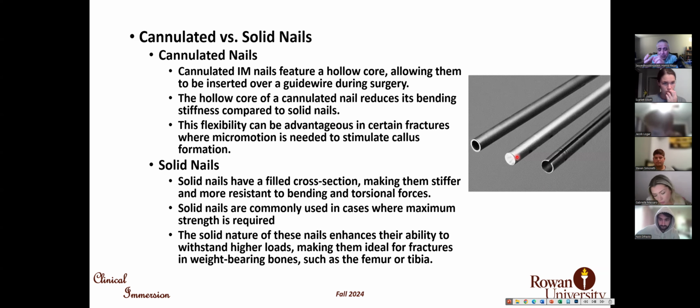If we use a cannulated nail, you will see first we have to put a guide wire, and then perform reaming, and then change the guide wire, insert another one, and then insert the nail. And it takes about 1 hour. But if we use the solid nail, we open the medullary canal and insert the nail, and it takes 5 minutes. In good hands, not in any hands. In good hands, it takes 5 minutes. So sometimes to save the patient's life, we need to use a solid nail. That is why they are still in use.